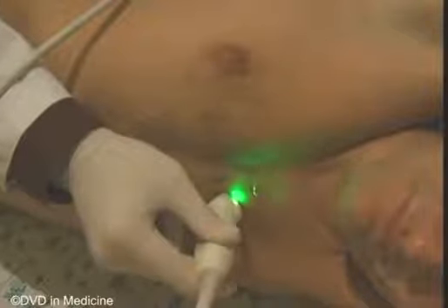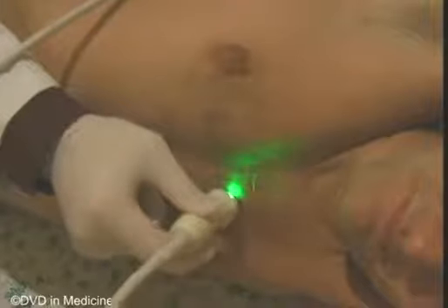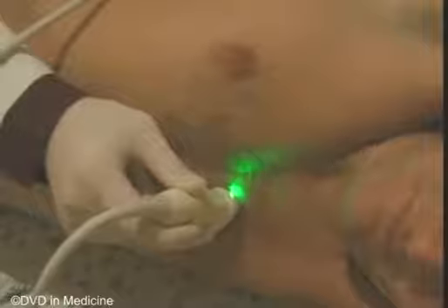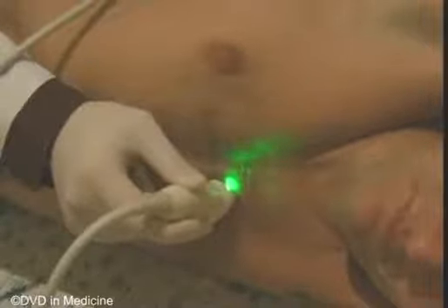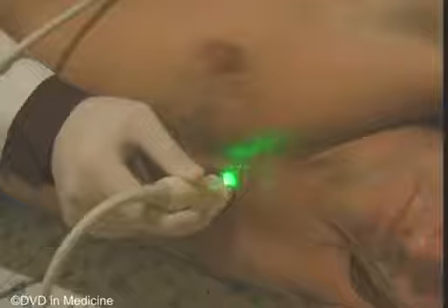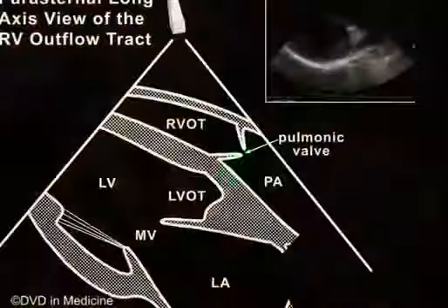After one has obtained a good image of the left ventricle from the parasternal long axis view, one must rotate the transducer a bit counterclockwise and angle it at a sharp angle between the transducer and anterior thoracic wall. It will appear as if one is trying to look under the left shoulder joint. Sometimes this maneuver is not easy. It is helpful if the patient will hold his or her breath after exhaling.